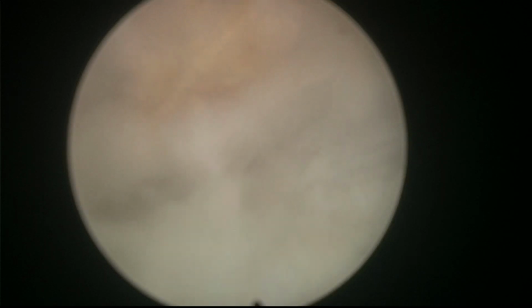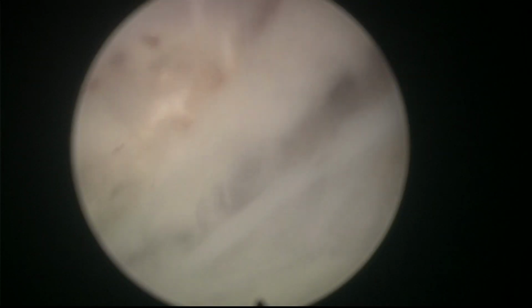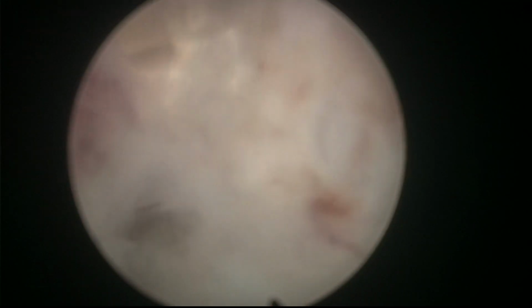See here, there's some adenomatous tissue anteriorly. So let's work on this anterior line slowly. You see here, for example, we know that we are in a good plane here. So let's take it towards the midline anteriorly and keep the fiber up. You see now the sphincter is separated from the apex, so we are quite happy that we're not going to stress the sphincter anymore.